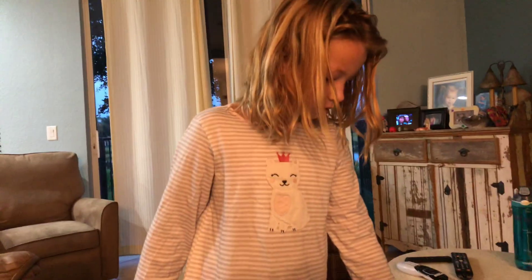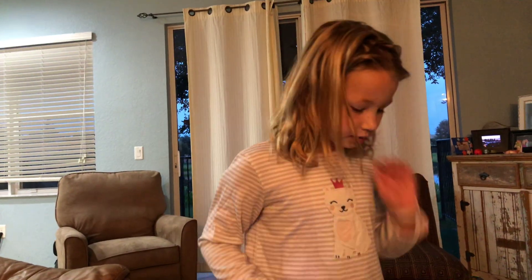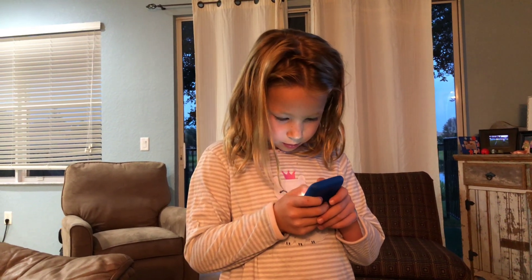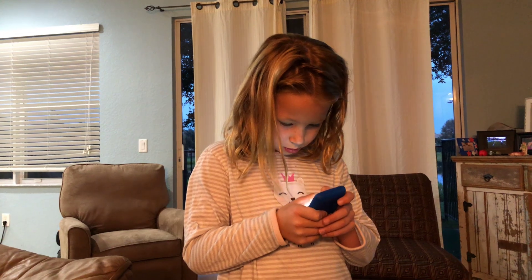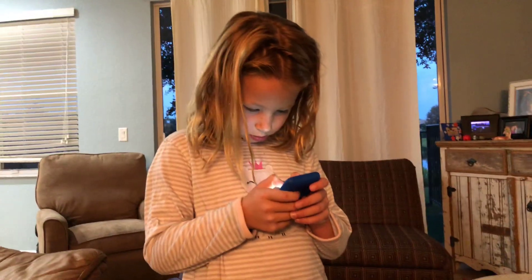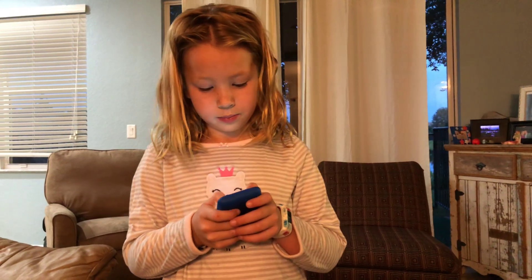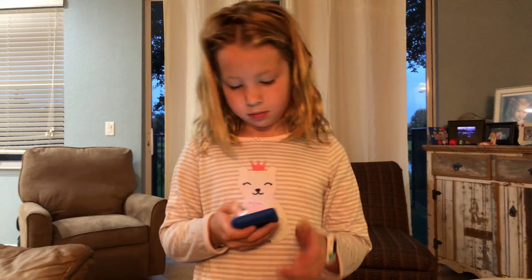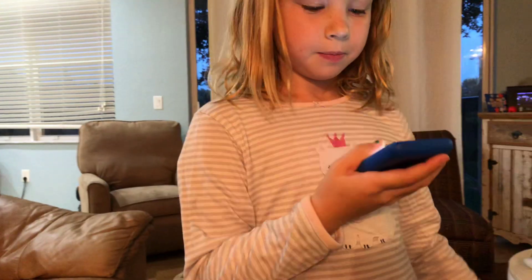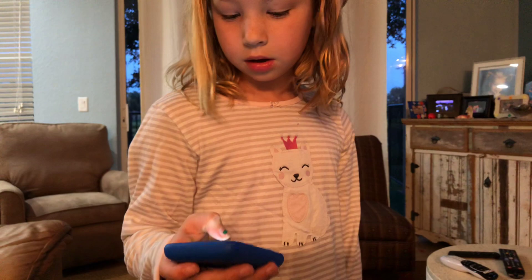Now I didn't enter the code — I have to enter the code. It was 9-1-1-7. Now we're going to save the code. Sensor code is saved, hit next, next.